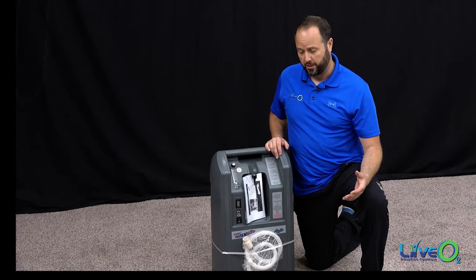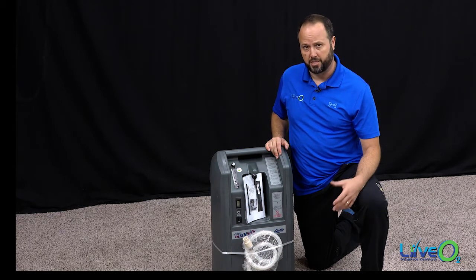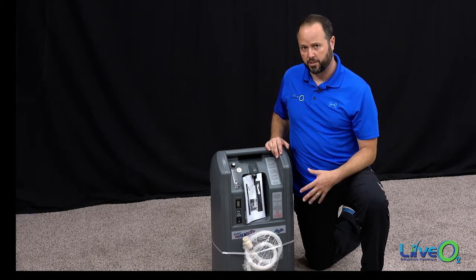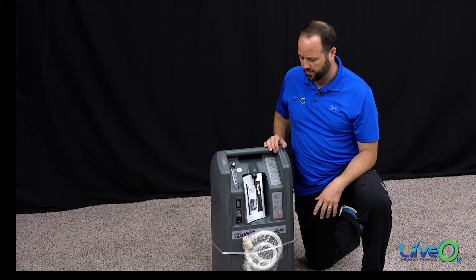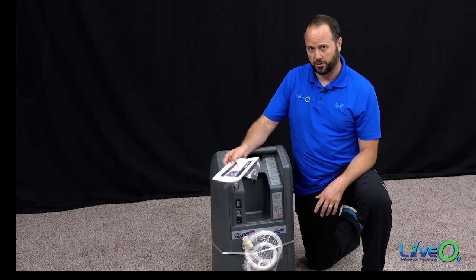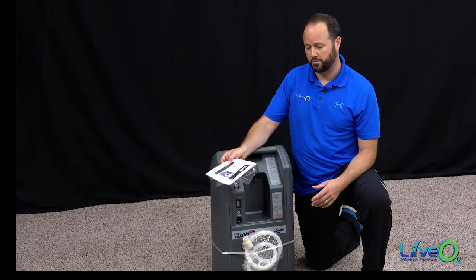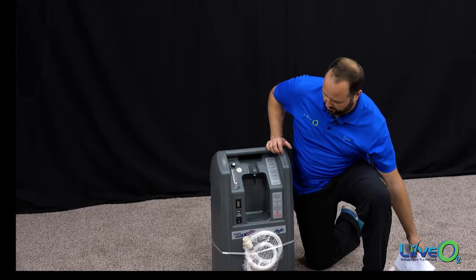Before we go through the final installation of the air separator, attaching it to the adaptive contrast reservoir, there are a few things we want to point out on the front of the air separator. Each unit will come with a user's manual. This is helpful to read and goes through troubleshooting should you need it. Set that aside and hold on to it.